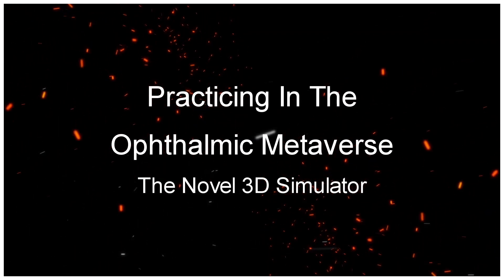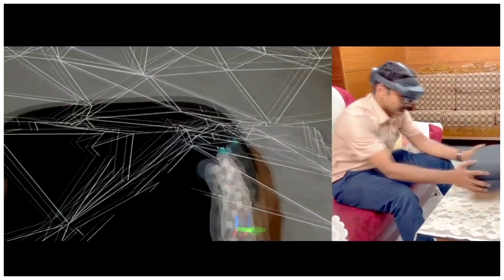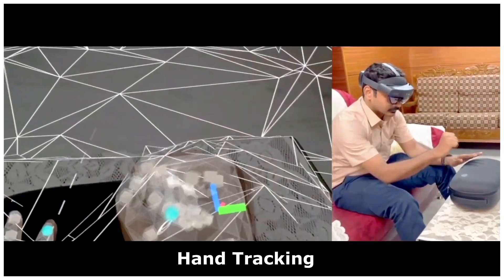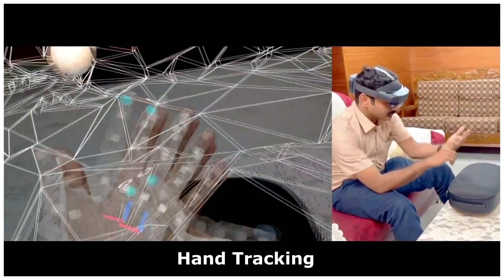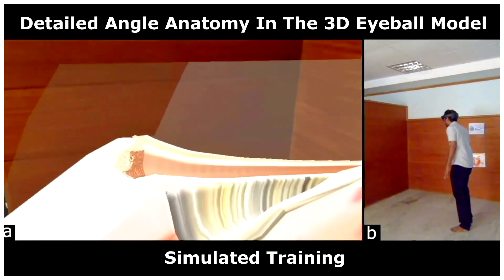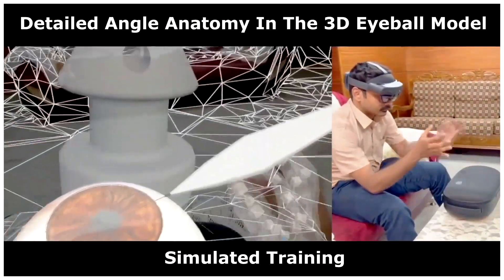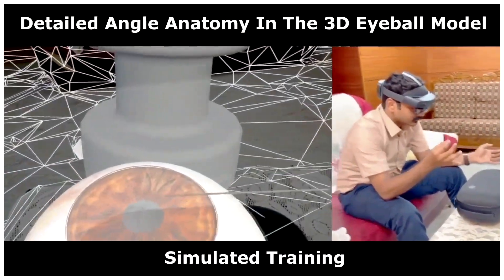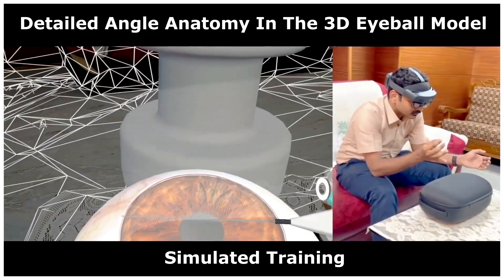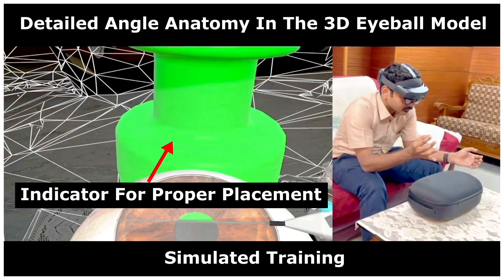Practicing in the ophthalmic metaverse, the novel 3D simulator. With the use of hand tracking in the HoloLens, a simulated training module can be created. The 3D eyeball model gives a real-time simulation of the angle structures to practice the implantation of the iStent. During simulated training on proper implantation in the trabecular meshwork, the indicator lights up green, improving the agility of the doctor for iStent implantation in the angle.